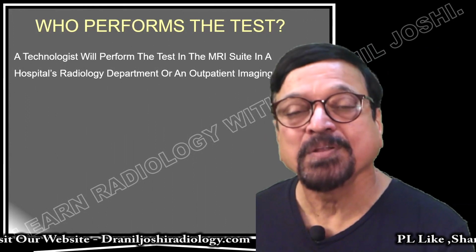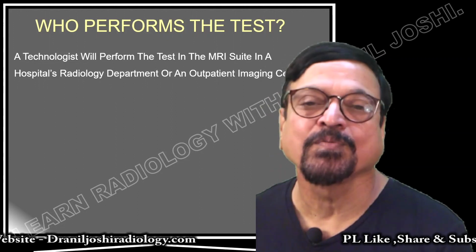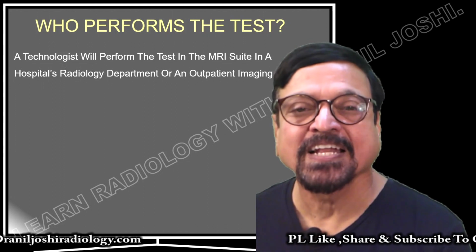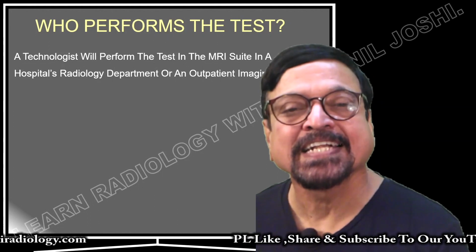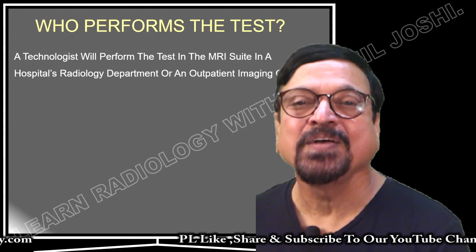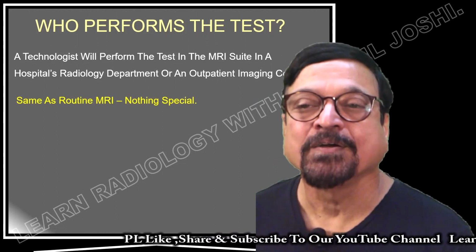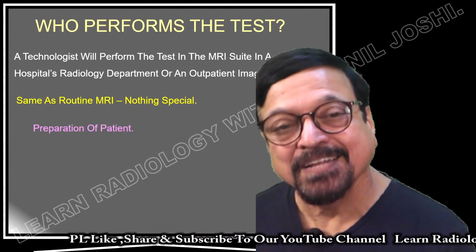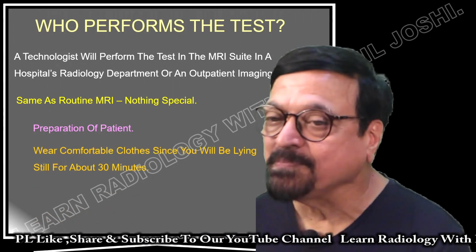A technologist will perform it. Now how the test is done, as I told you, it's just an extended part of routine MRI. We have extensively covered all these things in some other lectures. Please visit our website to know how a routine MRI test is performed, what are the prerequisites, how you have to prepare, but let's have a summary of it. Now you will have to go to the radiology department, same as that you go for a routine MRI. You will not feel a difference whether MRS is done or routine MRI is done. Then there is preparation of patient.